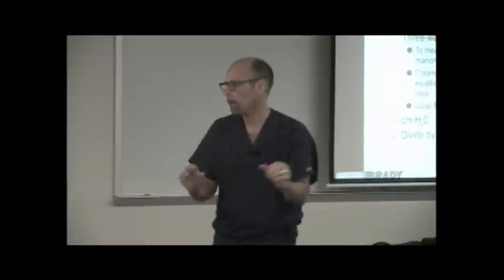Concepts making sense? Okay? Understand this, though, that for the last 40, 50 years, we've been hanging our hat on central venous pressure and right atrial pressure as a way of really getting at this concept of preload, but it's invasive. There are other ways that we can figure this out that are not invasive. I can do an echo and look at that. There are Doppler devices that I can place on the patient's neck and on their chest that measure the stretch without putting a catheter in the patient. That probably work a little bit better in a lot of circumstances.